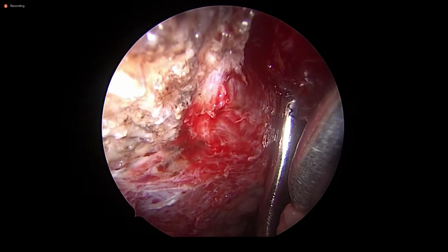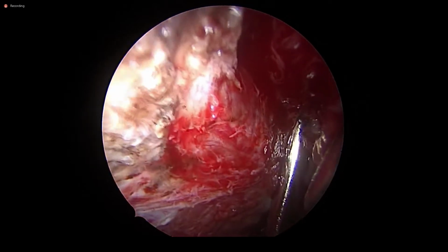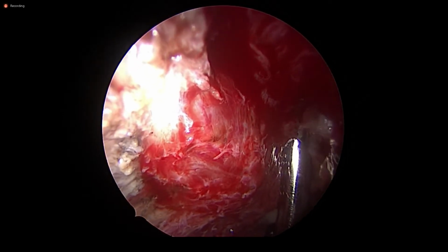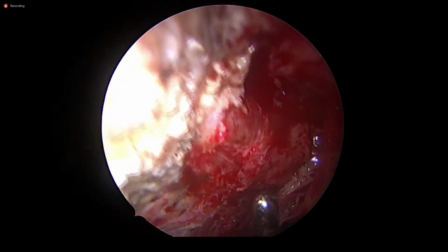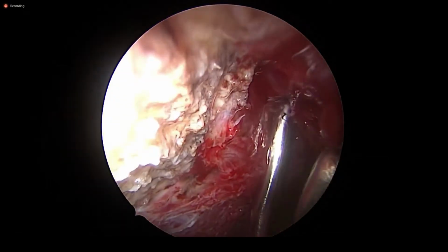All the adenoid tissue is going to jump and fall into the blade. See, there's a lot of adenoid tissue still there. See the amount of adenoid tissue which is falling.